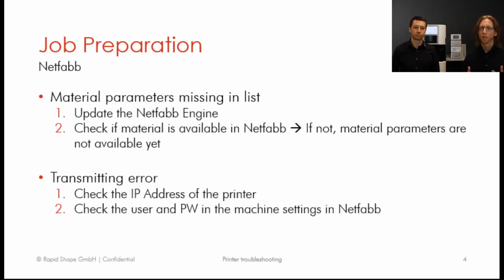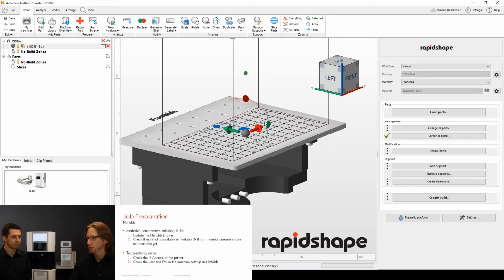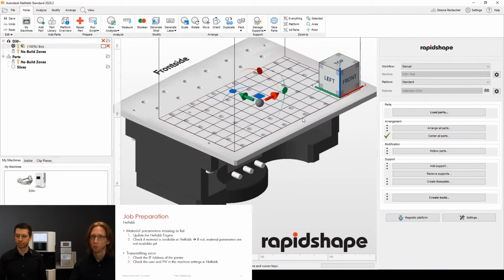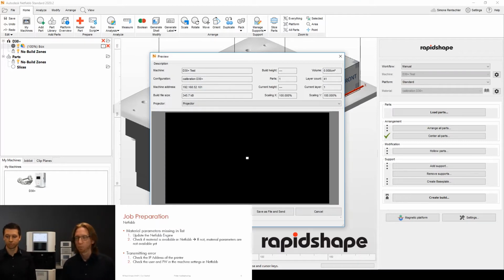Alright, the next thing would be a transmitting error. There we could actually have three possible reasons for that. Let me show you this in Netfabb directly. Just a second please. So here we are. This is the machine environment which we are all used to. What we see here is I prepared a very small cube. I just wanted to create a small object so that we can have a really quick slicing process, and as you can see we already have a machine here. It's the D30+ Test and a certain material, and let's just create the build to see what happens. The slicing process should be fairly quick now because it is a small and tiny object, and let's see what will happen when I press send to printer.